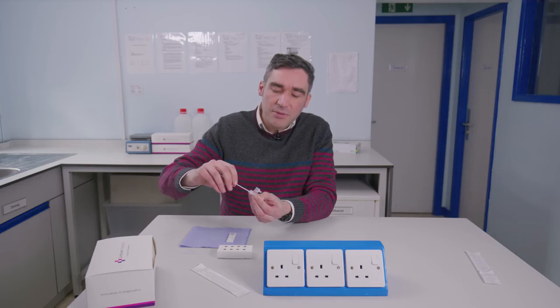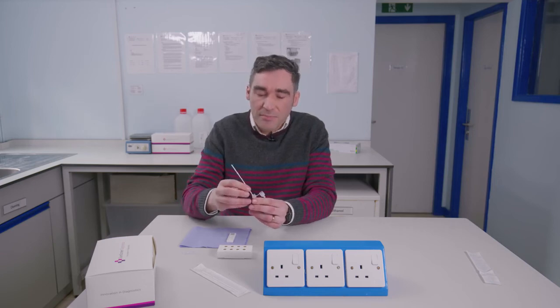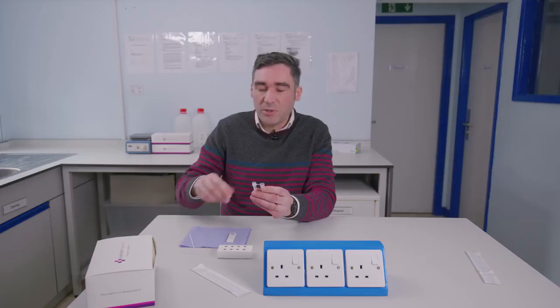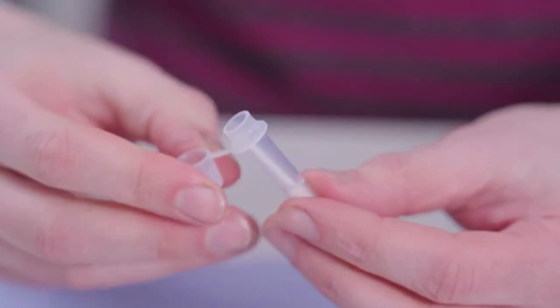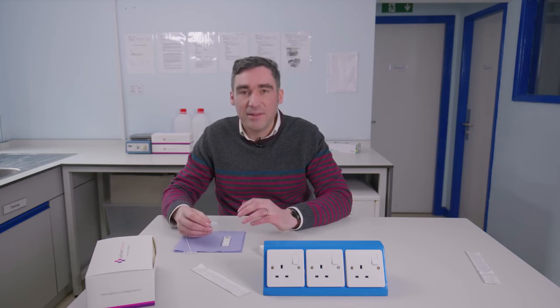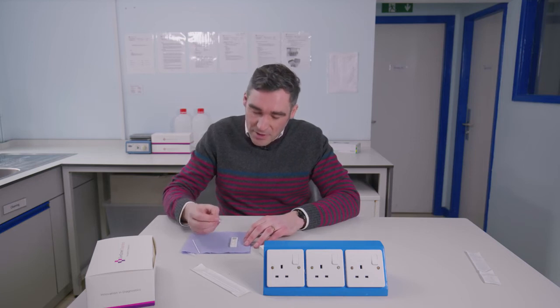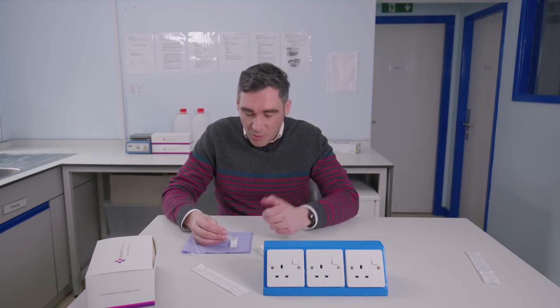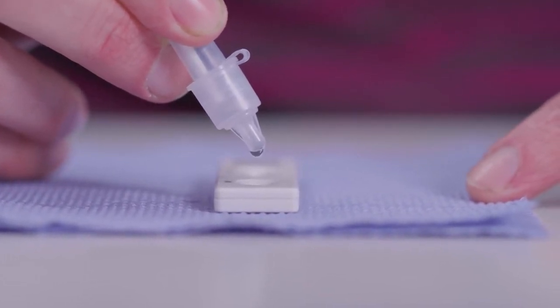We do that around 10 times and then we need to break the swab. There's a little notch halfway down and we do that so the bottom of the swab remains in the vial like so. Then it's a case of closing the top over, which works as a dropper, and we just add the buffer into the cassette. It requires three drops, so we add the sample now — one drop, let it absorb, then drop two, and the last drop.